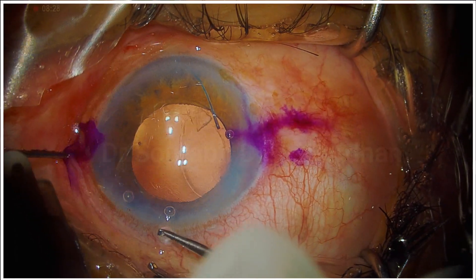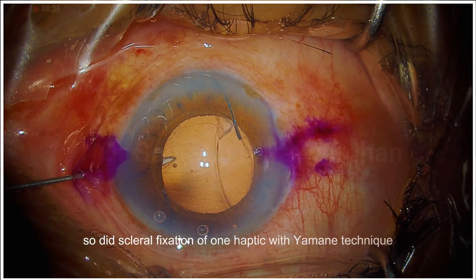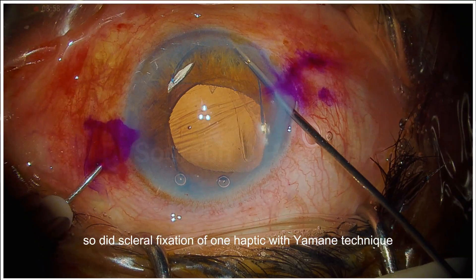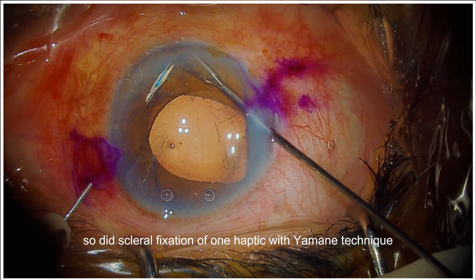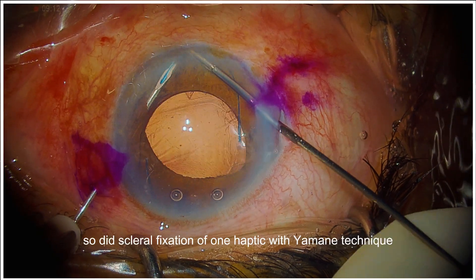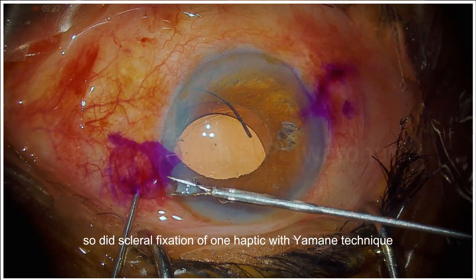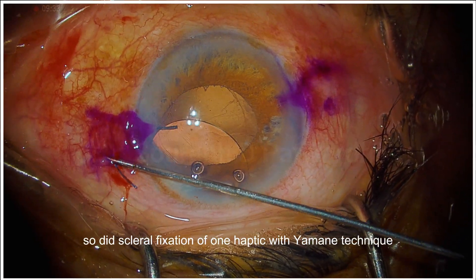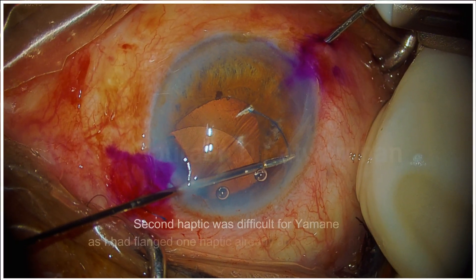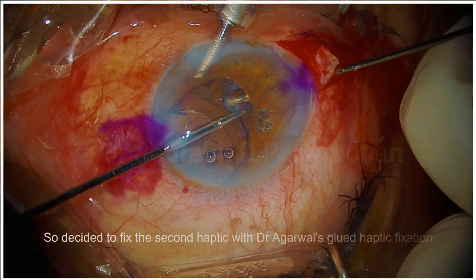So I am going to do the Yamane technique. I have already placed the IOL in the anterior chamber. Luckily, I placed a three-piece IOL and not a single-piece IOL, so I can fix it using the Yamane technique. I use a 26-gauge needle and thread the haptic into the bore of the needle, take it out, and using low thermal cautery, I create a flange bulb at the end of the haptic. So one end is flanged already.